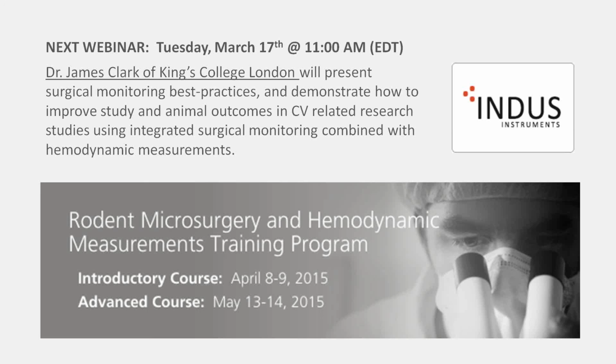So this pre-occlusion data helps with the stabilization of also the catheter in the cavity. I've seen many times that after stopping the ventilation in the inspiration phase, the catheter magically gets into the middle of the ventricle, and you do occlusion, and you have a beautiful ramp of pressure and volume going together. So yes, it always helps. And again, going back, why are we ventilating animals? Because we have better control over the prep.